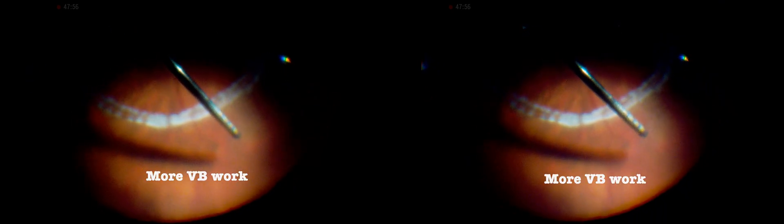Next, an inferior relief retinotomy is performed, creating a small hole. Subretinal fluid is released, further flattening the retina. Note how far the first row of laser extends — this makes further vitreous base work easier, paving the way for subsequent procedures.